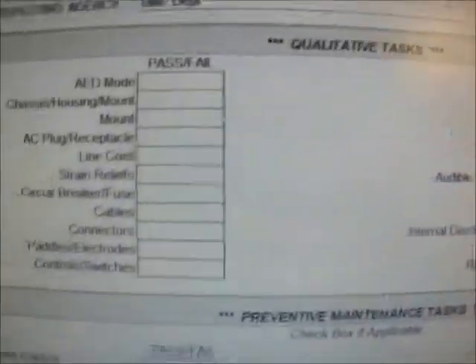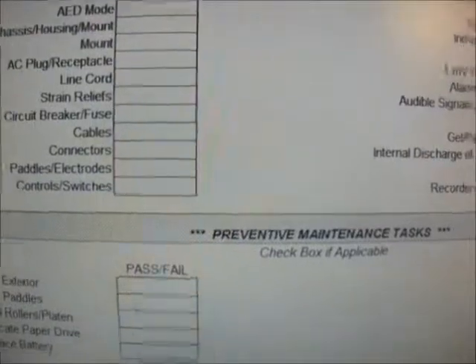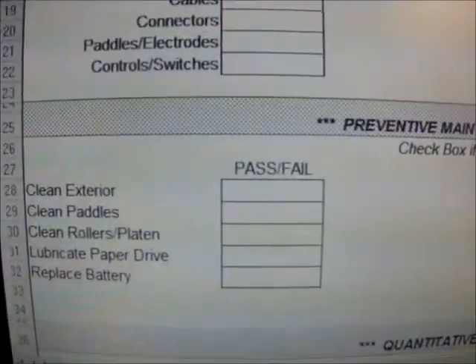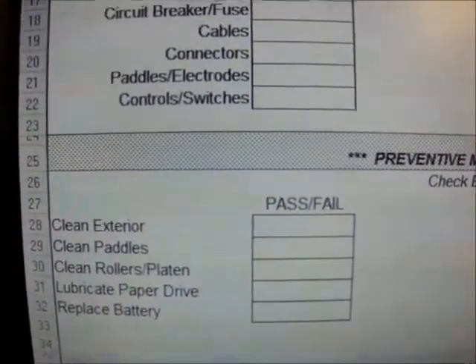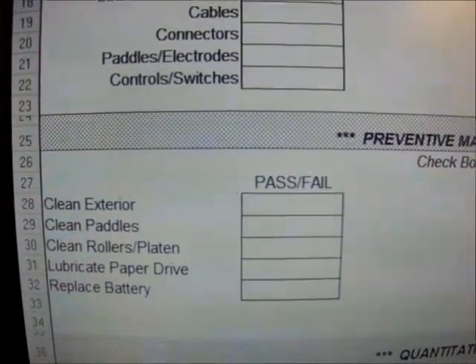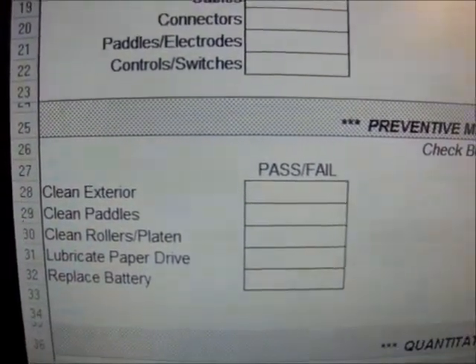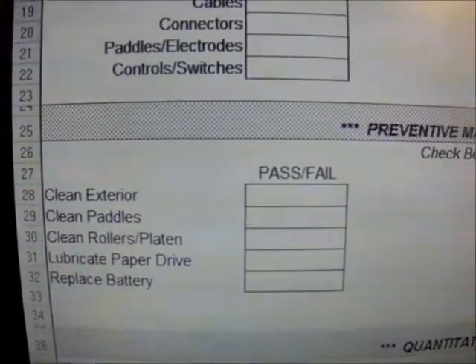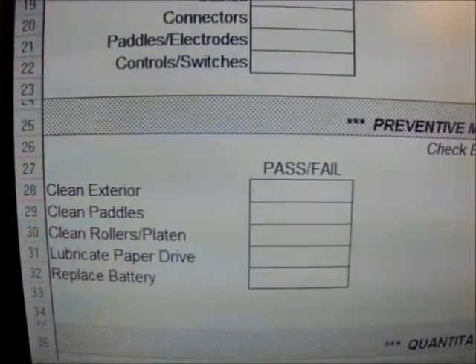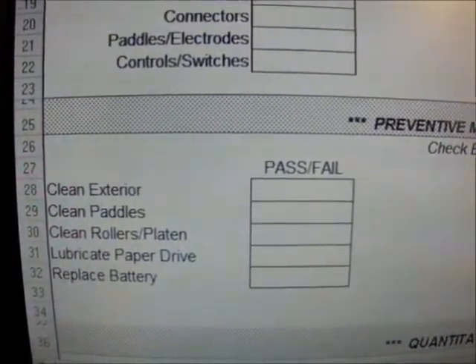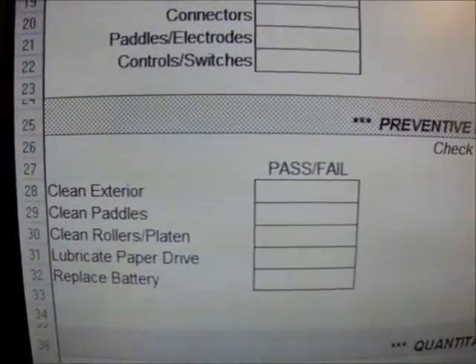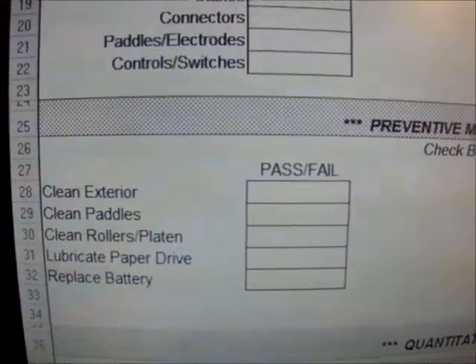Moving along to preventive maintenance tasks. Here are some of the preventive maintenance tasks: we will clean the exterior, clean the paddles, clean rollers, lubricate the paper drive, as well as replace the battery every two years.